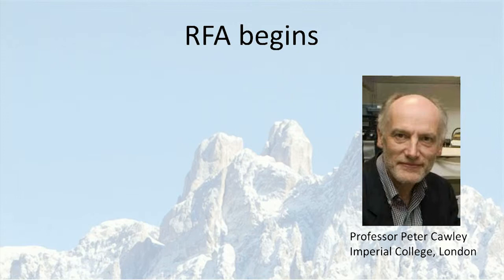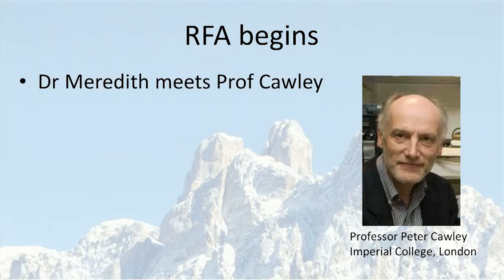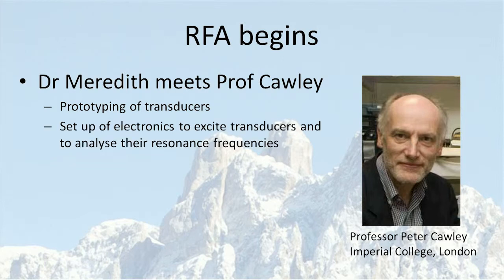And Peter is at Imperial College in London, and his speciality is vibration engineering. So these two guys meet, and they start to think about how to do measurements using resonance frequency analysis on dental implants. So they do some prototyping of transducers. They have to do a setup, of course, of electronics to excite the transducers and to analyze their resonance frequencies. And this is before mobile phones were a great product. This was before electronics were very, very small and fast.